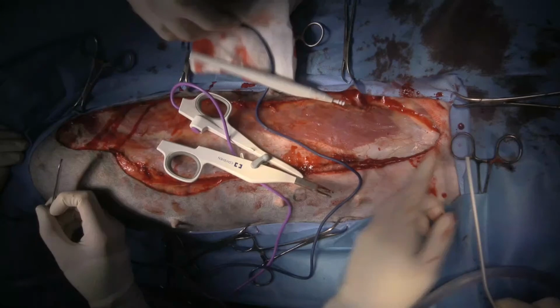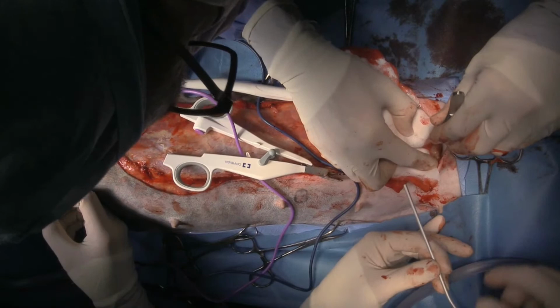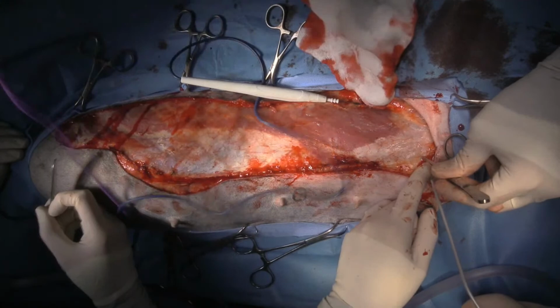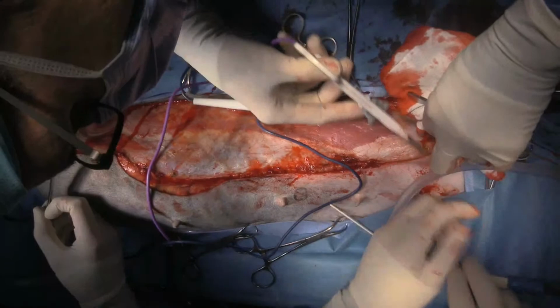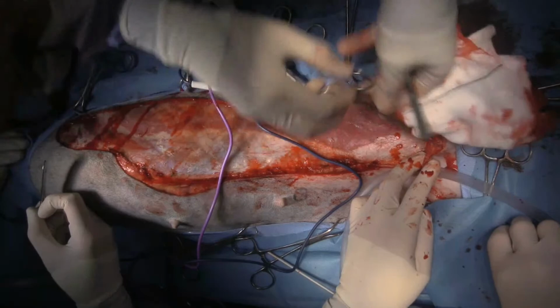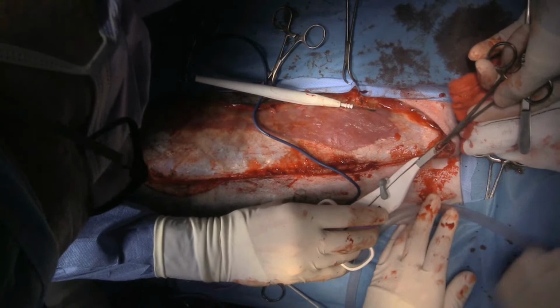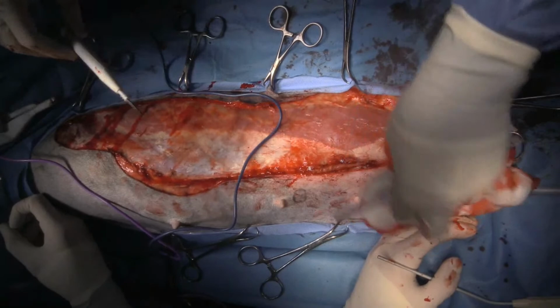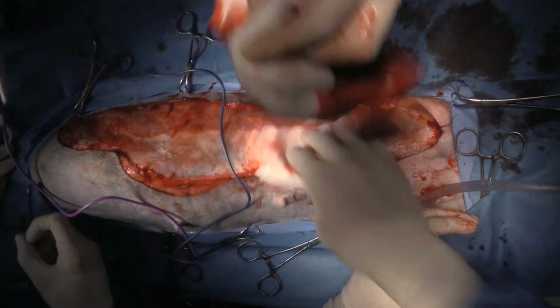All right, so we've got a little bleeder in here somewhere. Grab a hemostat. All right, can we get some mepivacaine, please? Sorry.